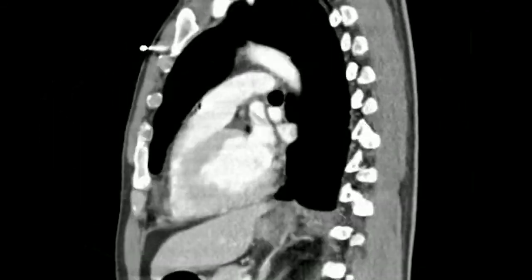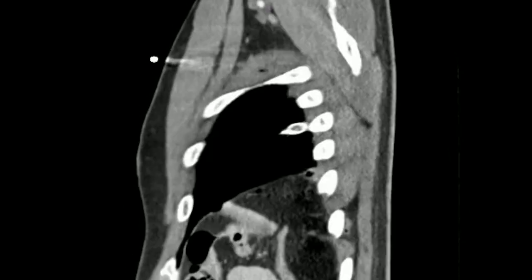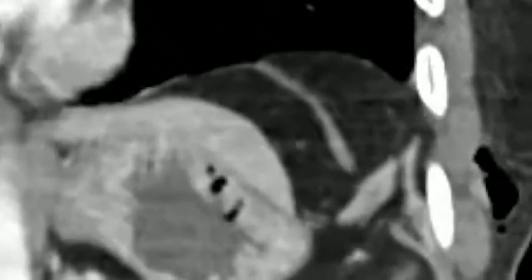Today's video covers a diaphragmatic repair done via robotic surgery on a man who was stabbed in his left chest. On the CT scan you can see the defect clearly — he has the greater omentum poking through his left hemithorax.